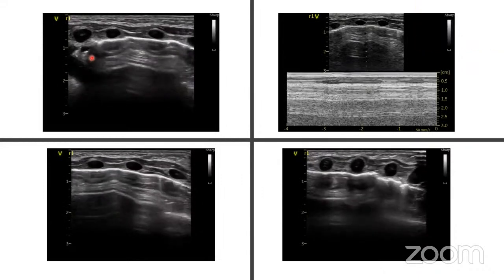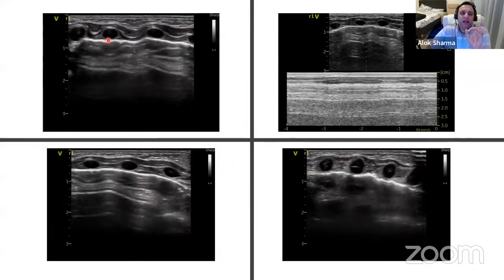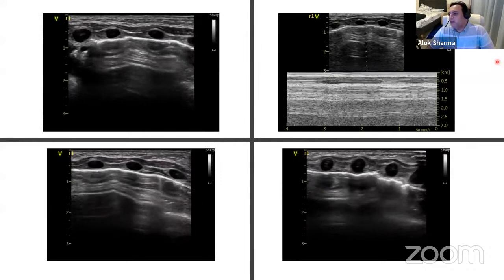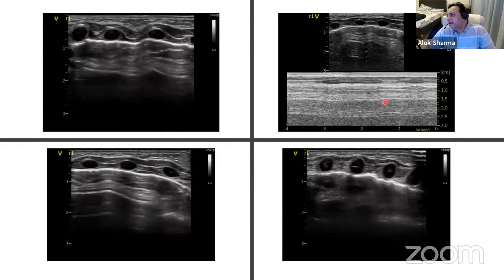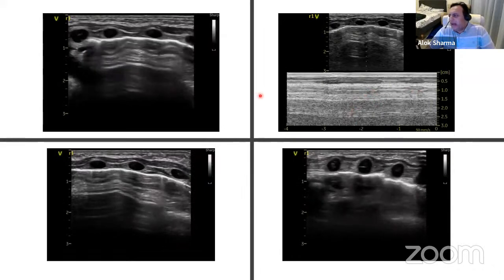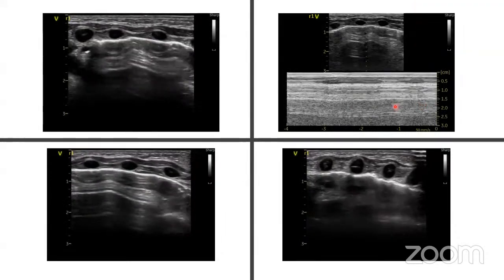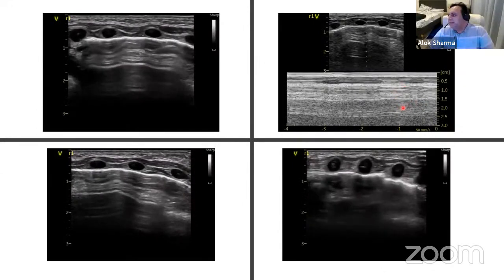Again, my advice would be that I haven't got the alignment as well. And I'd probably go higher up to try and see that in more clarity. But yeah, you're right. That could be a consolidation. But for me, I want us to focus on, are we absolutely certain that when you look at this M mode, what do we think? So Anna thinks this is seashore sign. What do the others think? I'm not too sure if this is seashore. I think it's seashore as well. Okay, what about here?